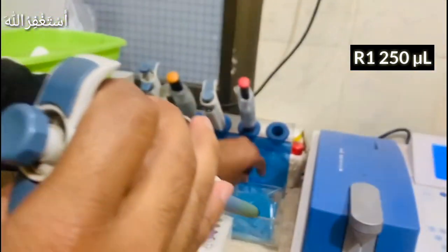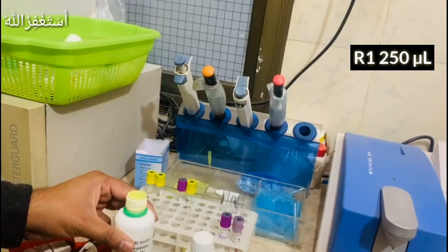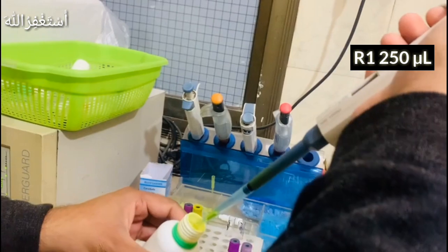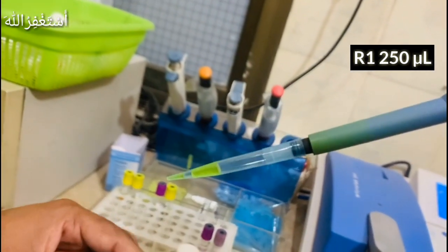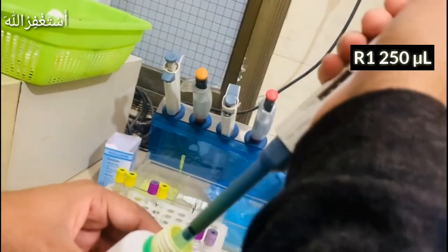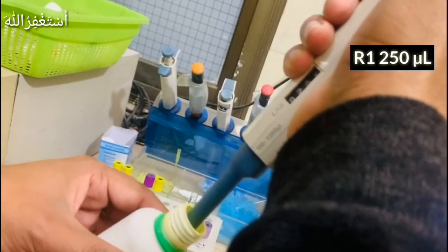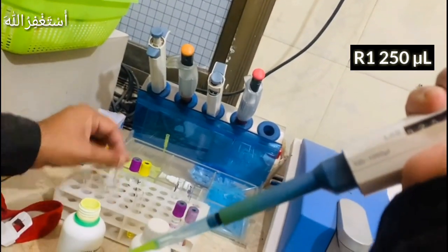Remember, we have to use a new tip each time. Sometimes we have to use it again so that our task is accurate. If our reagent volume is accurate, then our test result is accurate.